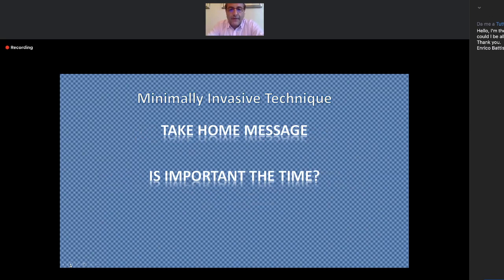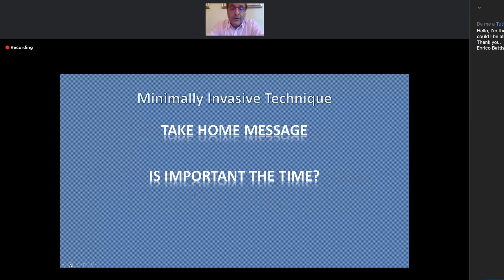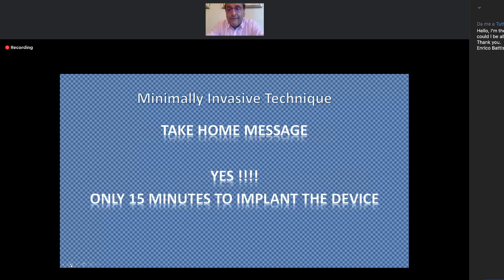This is my take-home message. The time is very important, because if you are very, very quick, only 15 minutes to implant the device, the risk of infection is low, very, very low. Next.